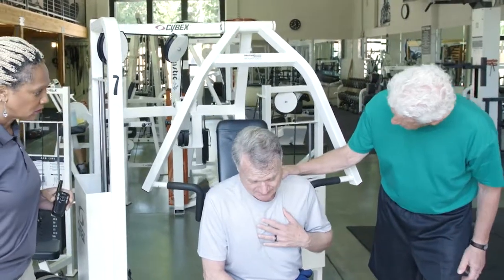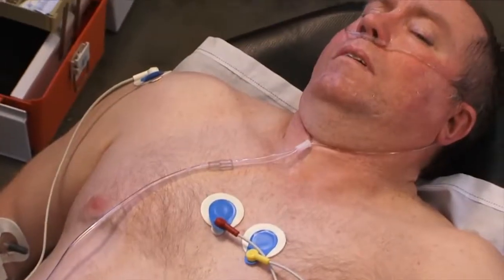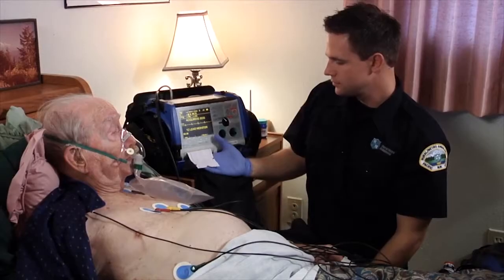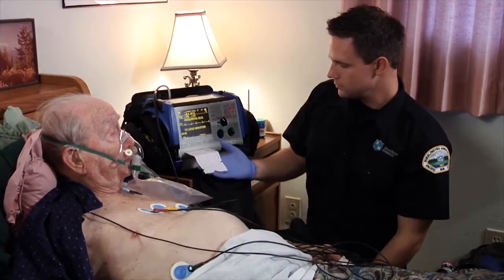So the purpose behind finding ST segment elevation is it's identifying patients that have that bigger, more mature clot that need immediate reperfusion and is very time sensitive. So the earlier you identify the STEMI, the sooner you're going to get them reperfused, thus the reduction in mortality.